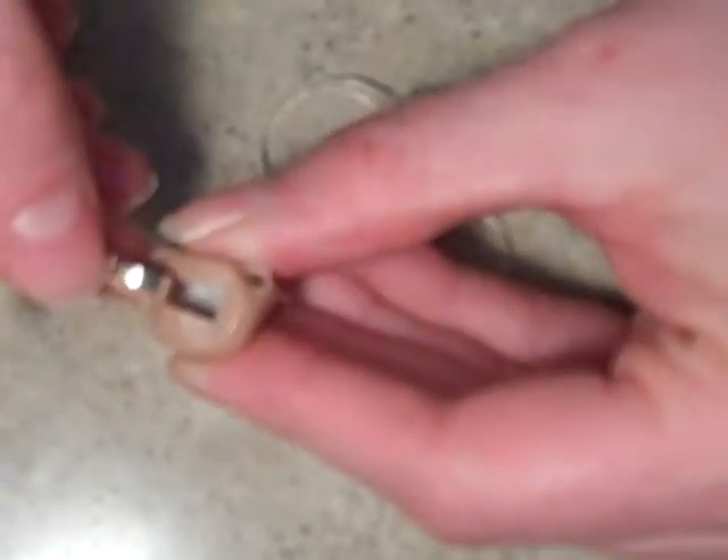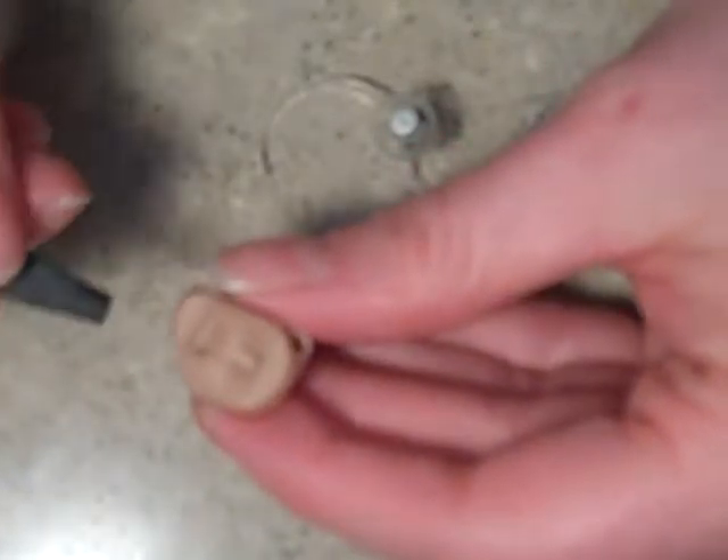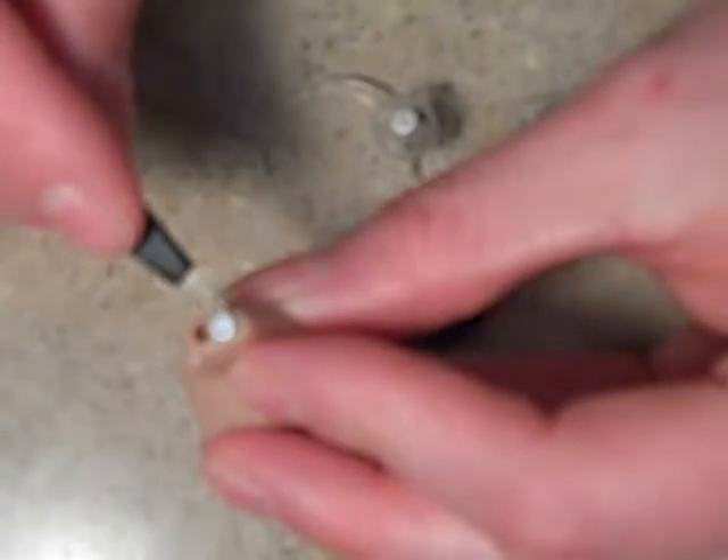They will all have a battery door that's easy to open and close. Some hearing aids will have a button to control your programs or volume, and most will have some sort of wax guard that protects your speaker.